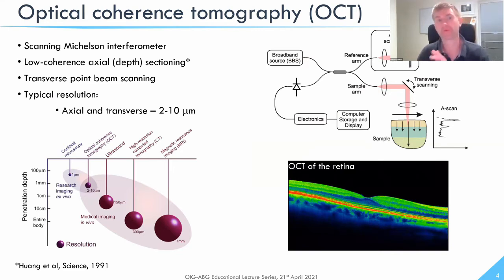As I mentioned on the previous slide, the optical technique we use is OCT. OCT is now quite prominent, particularly in scanning the retina, increasingly used in cardiology and dermatology, and researchers are applying it to a range of other areas.